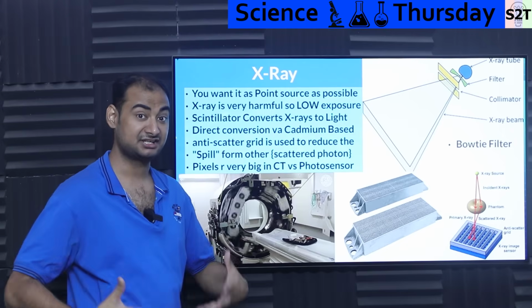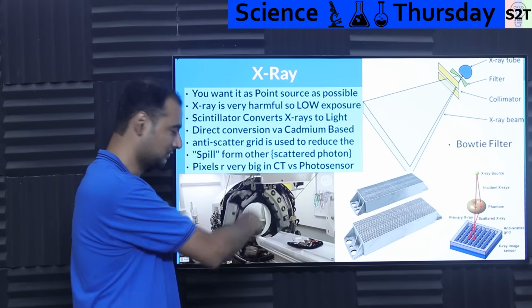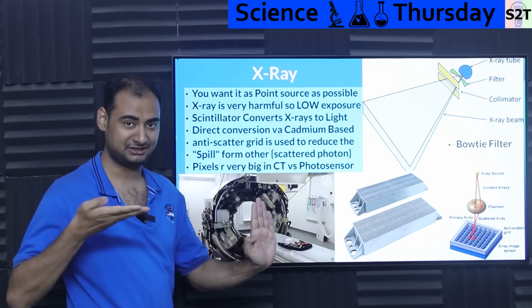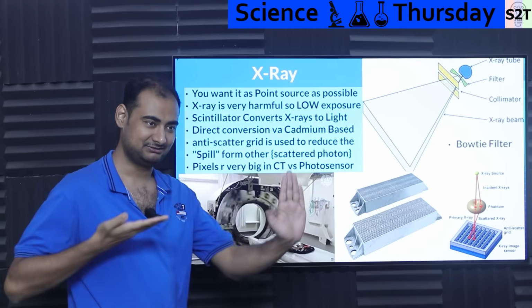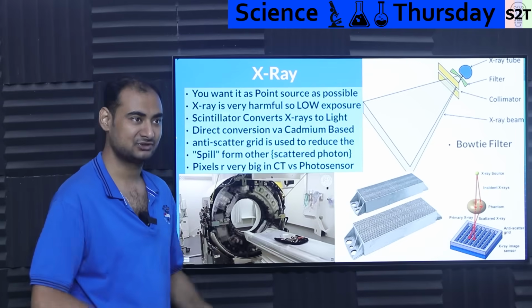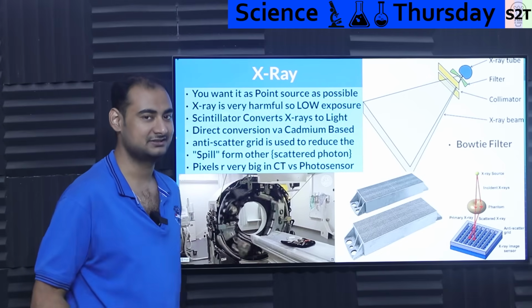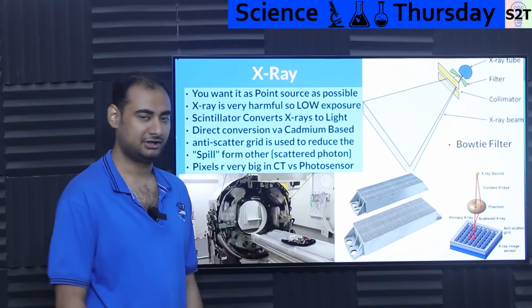They're like, how can you get such a high resolution of inside of the human body? Motion. That's why this puppy goes, and be mindful, that's one axis of motion, and you're just doing this also. You're two-axising it, so you're getting a lot of data. And again, you also have a lot of overlap. That allows another mathematical formulation to filter out the noise and crisp up the resolution. So that's the X-ray part of it.